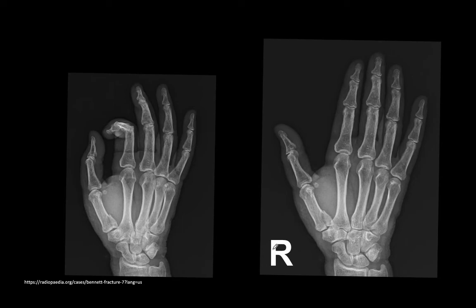Now, thumb base fractures. And when we talk about thumb base, we're really talking about the metacarpal base of the thumb. You'll notice there's a fracture here at the base. So there's two that occur here. One's Bennett and the other is Rolando. Bennett fractures are non-comminuted, meaning there's a single fracture line resulting in two pieces of bone from the one that fractured. So you'll note here one fracture line, two pieces of bone. This is non-comminuted. And at this location, it's called a Bennett fracture. There is a comminuted variety that we refer to as a Rolando fracture.